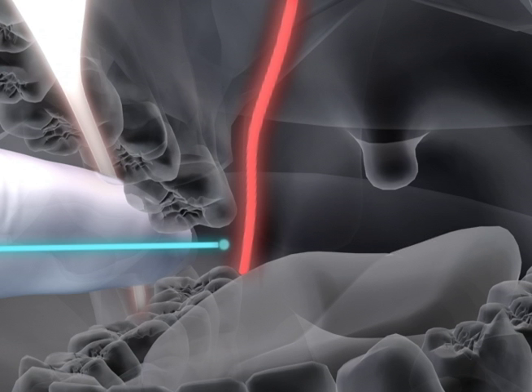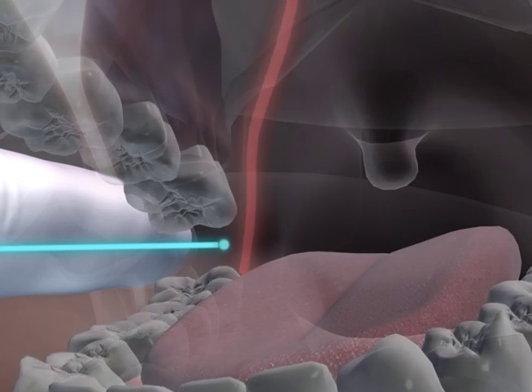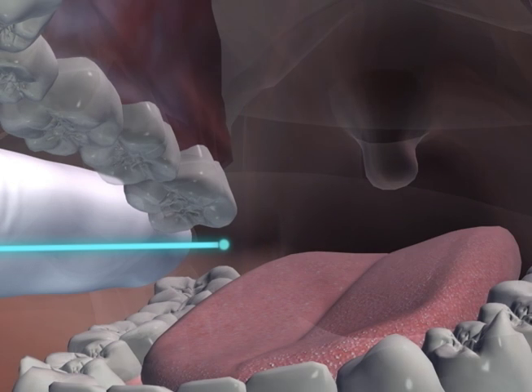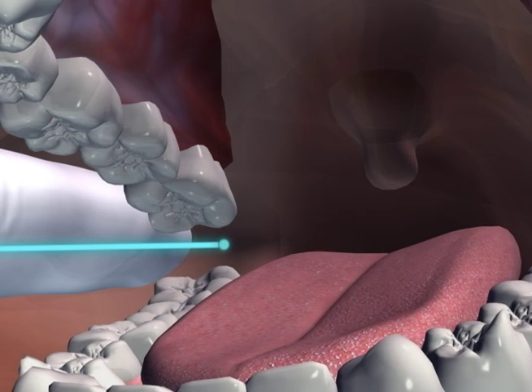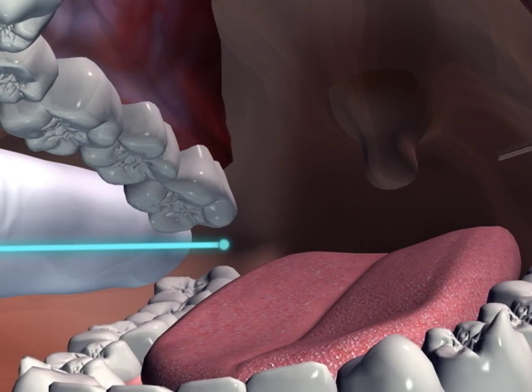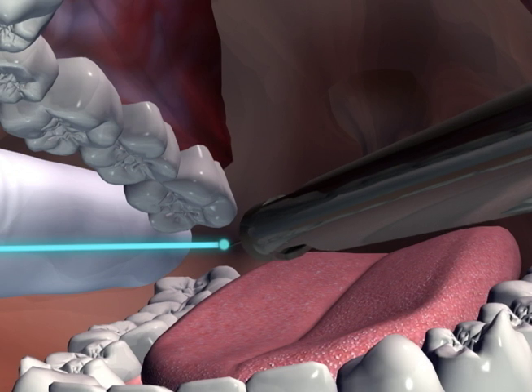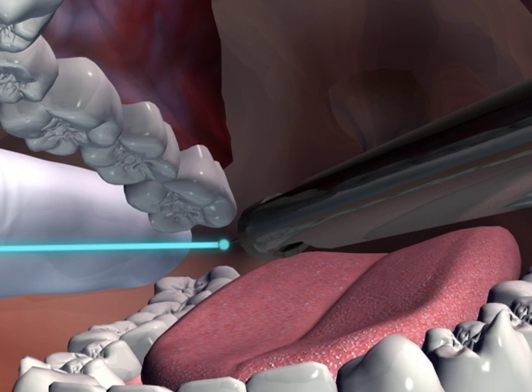Positioning the syringe over the premolar teeth on the opposite side and just above the plane of occlusion, the needle is placed at the insertion point within the depression, about one-fourth to one-half the distance from the raphae to the finger.